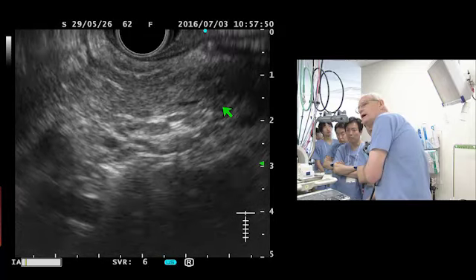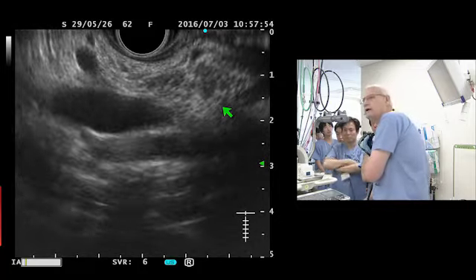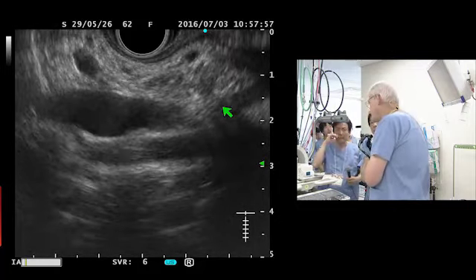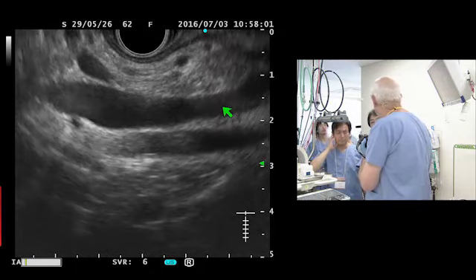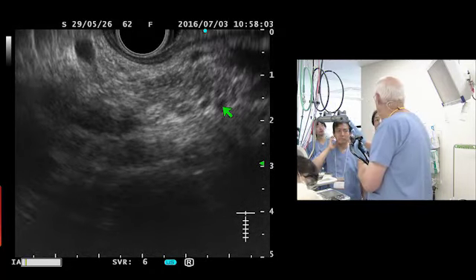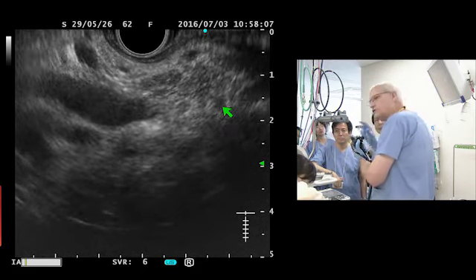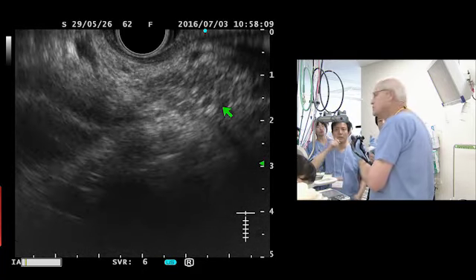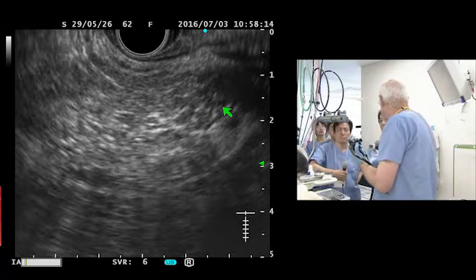And so I don't feel, Takao and Dr. Ryozawa, that this is necessarily needed to do FNA. I see a uniform chronic pancreatitis. I think this is a fibrotic stricture. Yes. I don't see any associated mass. Yes. So I think it is a case of idiopathic chronic pancreatitis.